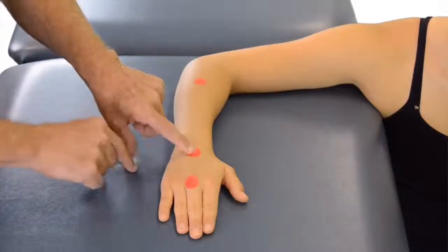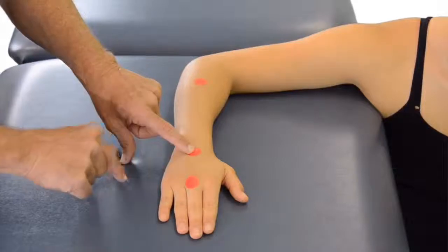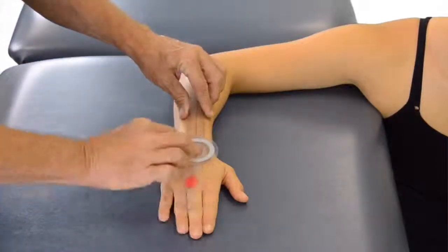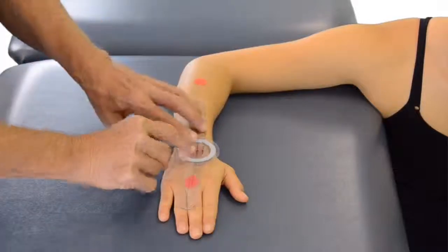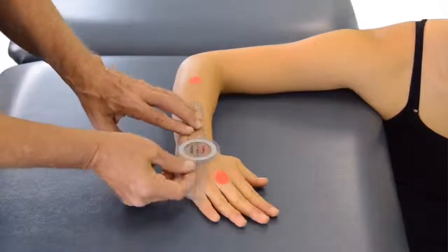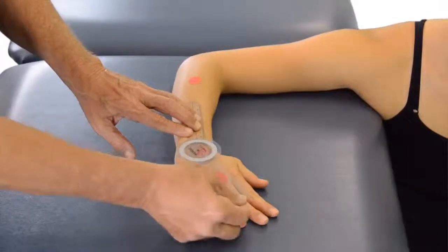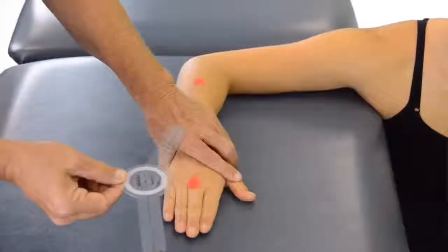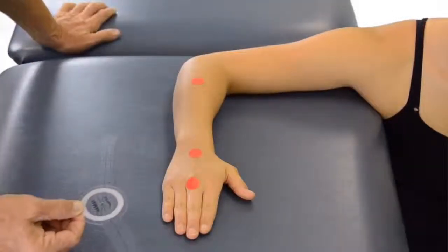Our moving arm will be from the capitate to the base of the third metacarpal. We align our goniometer in this position, move the patient into full radial deviation, and realign our goniometer along our landmarks. This gives us a true measurement of radial deviation of the wrist.